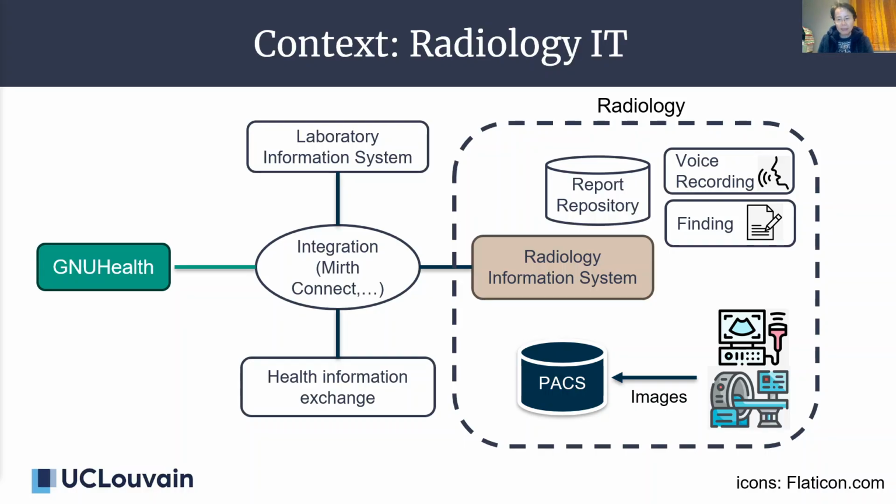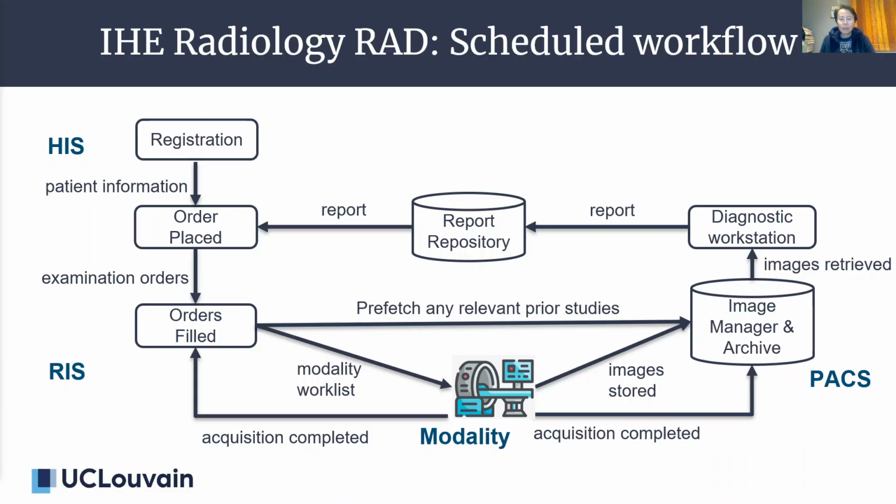The modality device, such as CT, they are all connected via the Mirth Connect connector. The data exchange between them can use HL7 messages. The IHE radiology framework was developed by Integrating the Healthcare Enterprise to ensure secure interoperability and communication between radiology systems such as imaging equipment, PACS, and electronic health records.